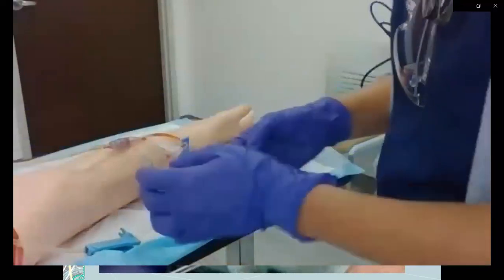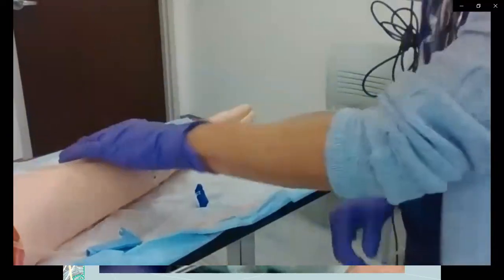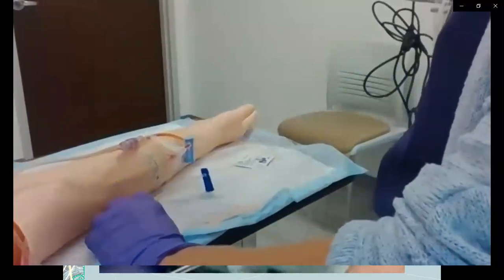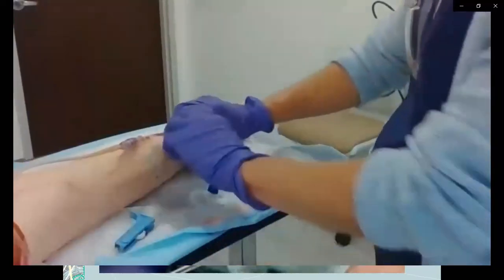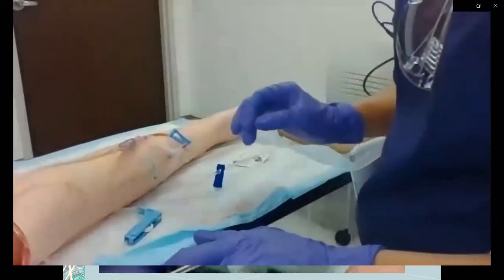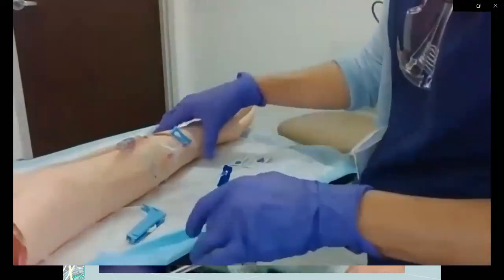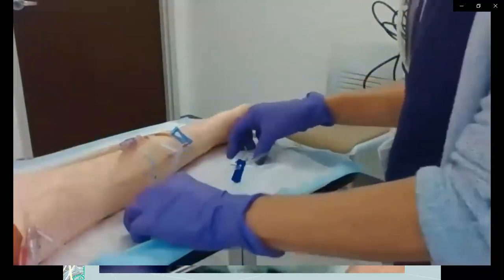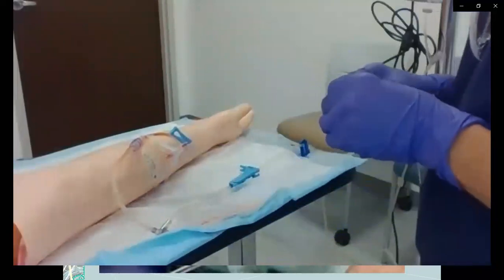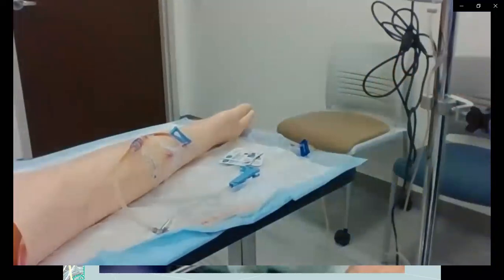Always before you connect, make sure you've already, as I said, we're just going through the motions. But remember, always flush your IV before starting your IV fluids. Make sure that everything is working well and you don't have any alterations in function of that IV, making sure that it's good and clean and dry and functioning well. So always flush ahead of time. But like I said, we're just going through the actual process of what you do to spike the bag and get the fluid through it.